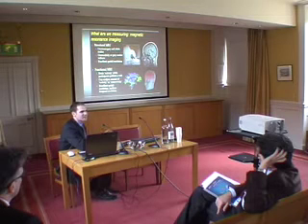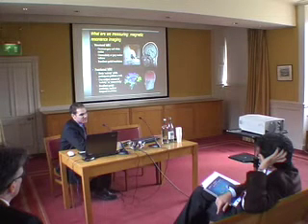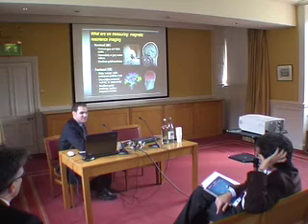And you can tweak the MRI machine in order to produce different types of signals to allow you to pick up white matter or grey matter, depending on what you're particularly interested in, so whether you're picking up the cells themselves or the connections between them. And of course it has the value of having really good spatial resolution, and that's what MRI tends to be used for in hospitals most of the time, obviously.